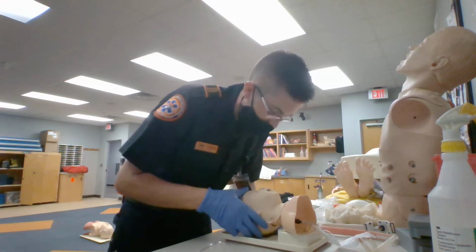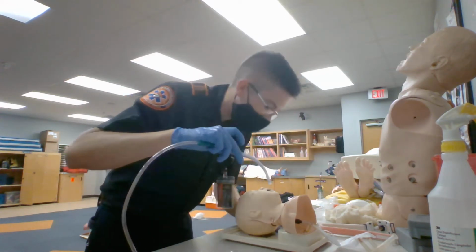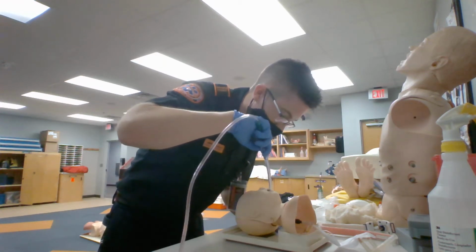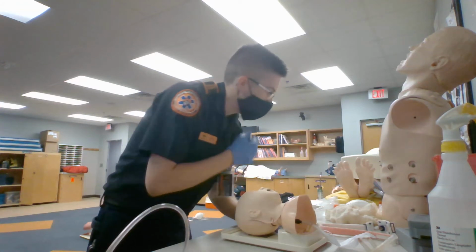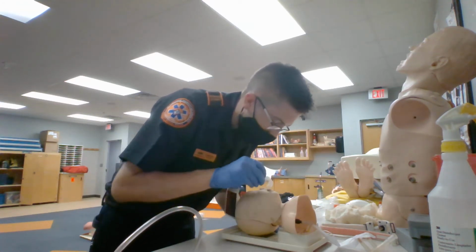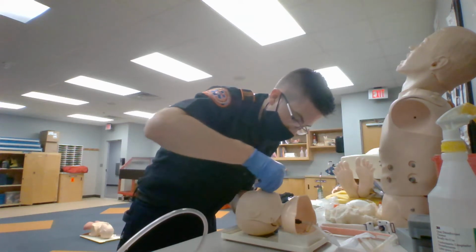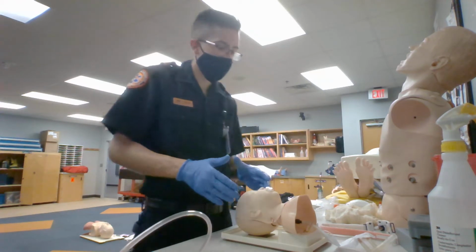Going to come over to my patient, manually open up the airway. If I see any vomitus, blood or secretions, I am going to suction out the airway for no longer than 10 seconds, doing a zigzag motion on my way out. I will then come over, re-inspect the airway, measure my OPA, insert my OPA, then I'm going to put a high flow nasal cannula on my patient.